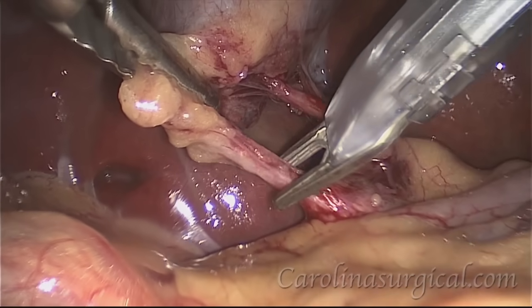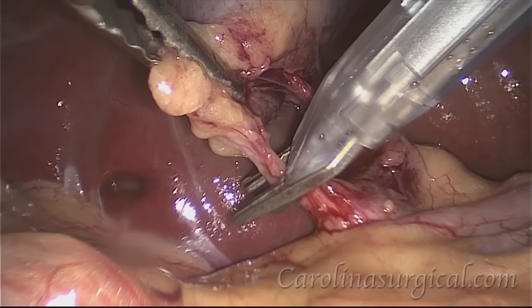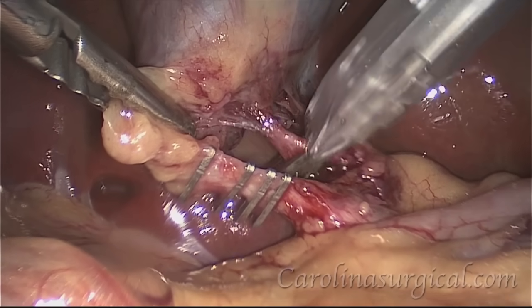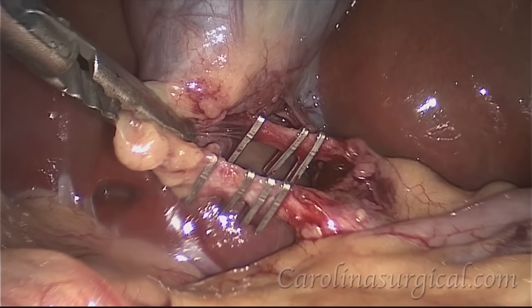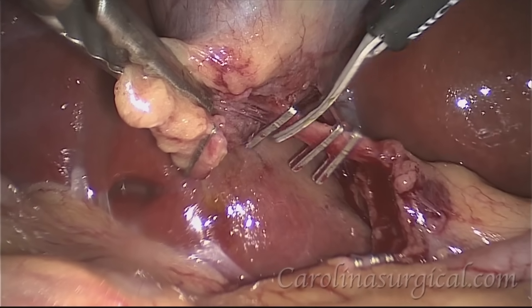Now that we have clearly identified the cystic artery and the cystic duct going to the gallbladder, we'll start clipping these structures so that we can divide them. We always like to clip first and then divide — we don't want to create any bleeding or bile leaking by cutting first and then clipping second. Now that they're clipped, we'll go ahead and divide the cystic duct and then the cystic artery.